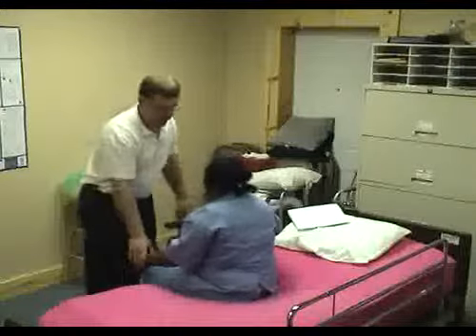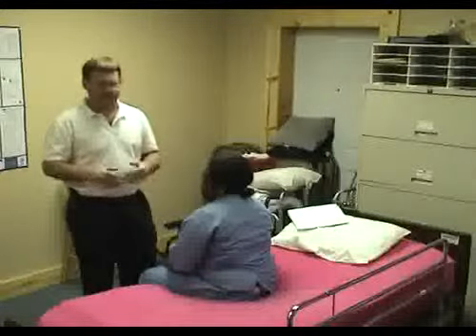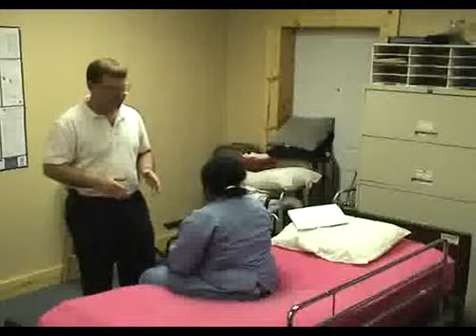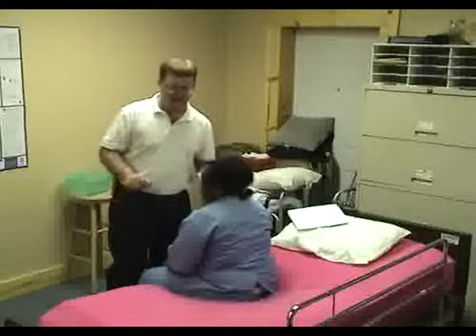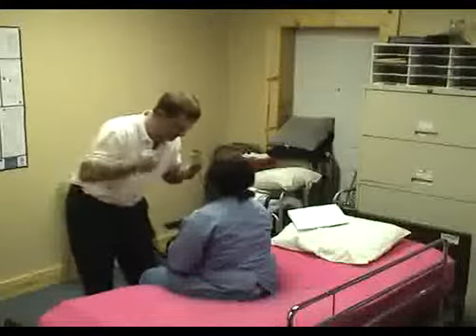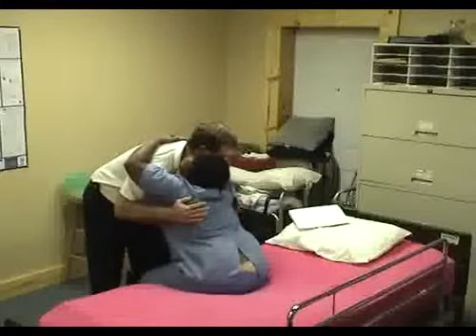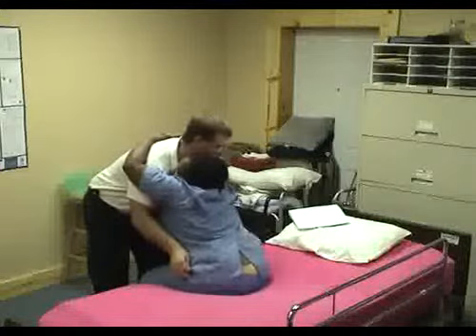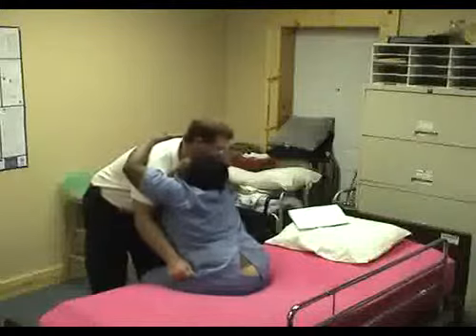Next would be someone that requires about 50%. We don't do deadlift transfers. Deadlift is someone that cannot help you at all. We don't do that. Now this is trying to get me to deadlift. This is someone who needs about 50%. And it is okay for them to say, go ahead, put your hands up around my neck, give me a hug. Now you put your hands up underneath of their armpits, either this way or like this, or you grab their pants on the sides. Don't grab them in the back because you give them away. You can grab them on the sides.